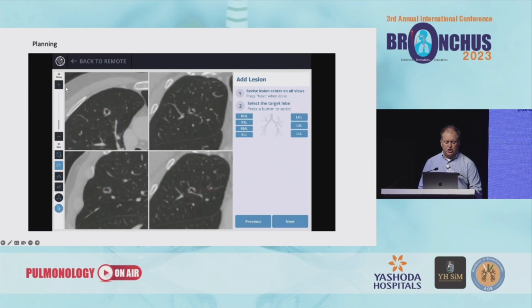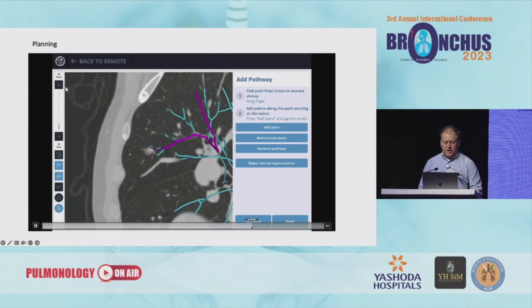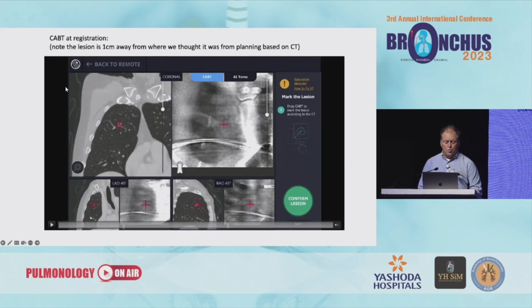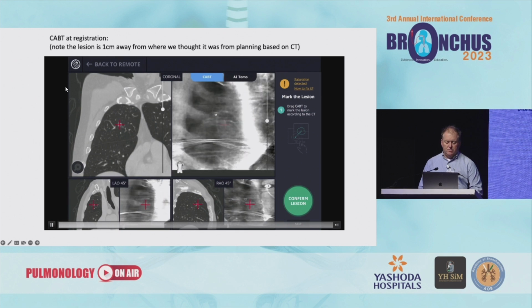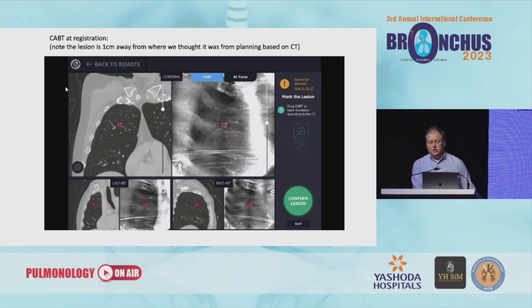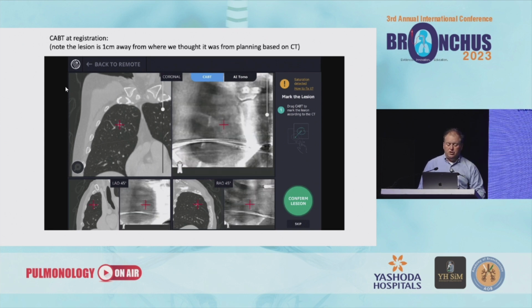And then this is similar, our case, the Monarch and using Lung Vision together. This was the lesion we were going after. Let me fast forward it up here. That's the planning. And then when we're doing the tomo spin, we're getting out near the lesion, we want to update the lesion's location. You can still see it, even these small, almost cystic-like lesions, using just a standard GE C-arm, and I'm sure it would work with any of the other competitor C-arms. You can update the lesion location.